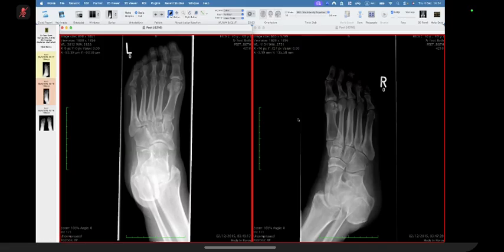On X-rays, sir, for osteoarthritis, predominantly, initially, there will be first a reduction of the joint space. In the early stages, there might be a mild joint space reduction, some amount of marginal osteophytes, some sclerosis along the articular margins, some subcortical cystic changes, that is because of the degeneration of articular cartilage along the joint surfaces, there can be some subchondral cystic changes, and in the chronic stages there can be complete loss of joint space. Okay. All right.